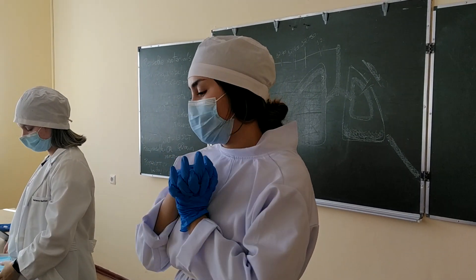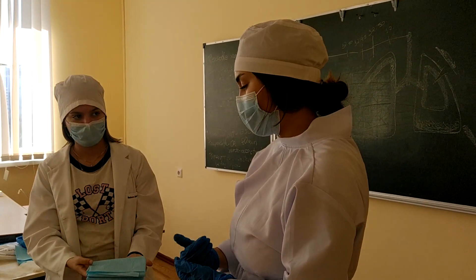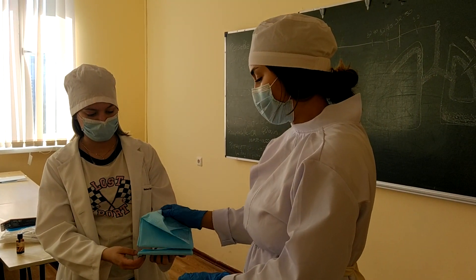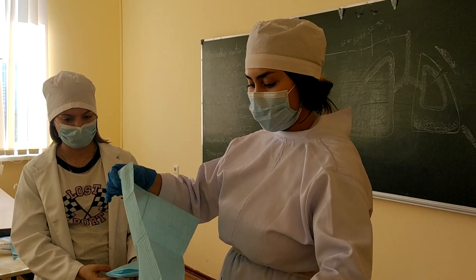Today I'm going to be teaching how to prepare a table for surgery. The first step is that the nurse assistant will bring a paper tissue for you, and then you will put it on the table.